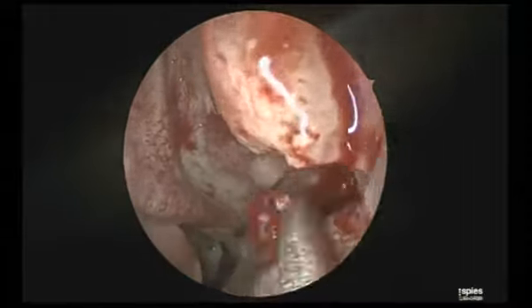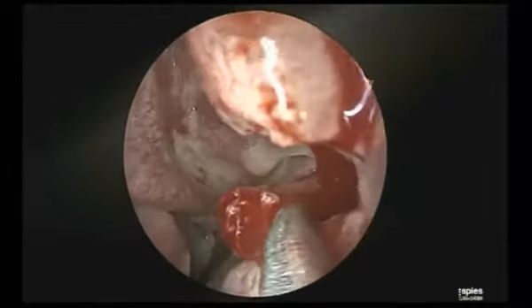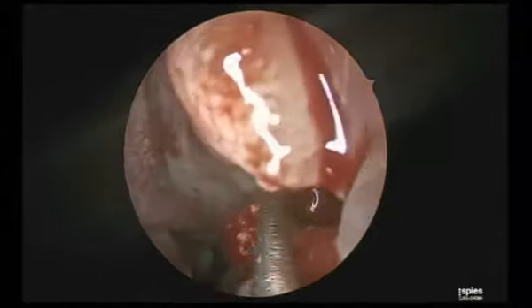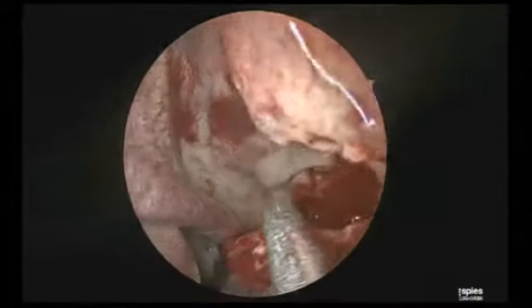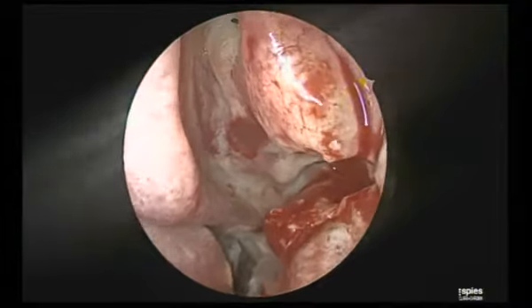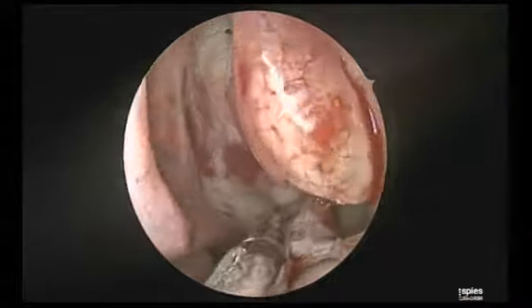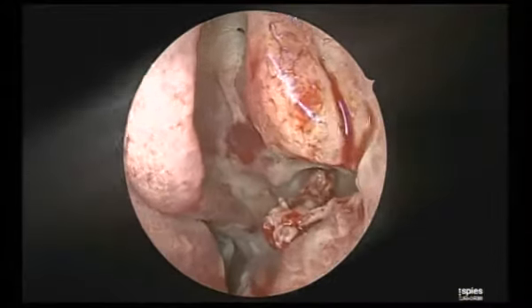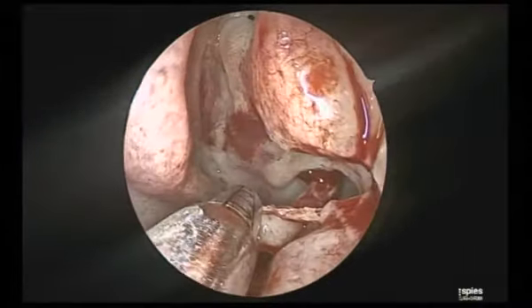The important thing is not to strip off the maxillary sinus wall. So what you need to do is keep the ball probe upturned. See, gently, gently, you can fracture it to see the maxillary sinus ostium. Now see, if I suck in this region, you will appreciate. Can you see the maxillary sinus ostium? Very nicely we can see. Now I can do so many things over here.